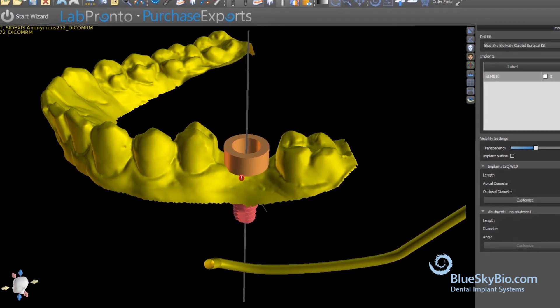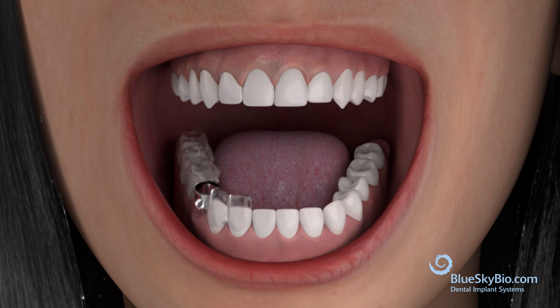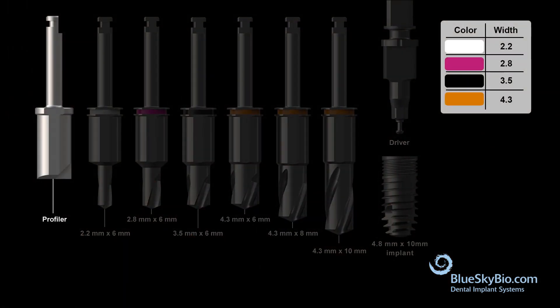Once the guide is finalized, it should be 3D printed and the metal cylinder should be seated within the guide. Be sure to verify the fit of the guide in the patient's mouth prior to proceeding with surgery. The drill flat profiler should always be the first drill used in any surgery.